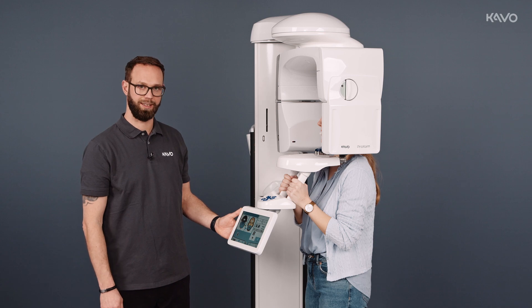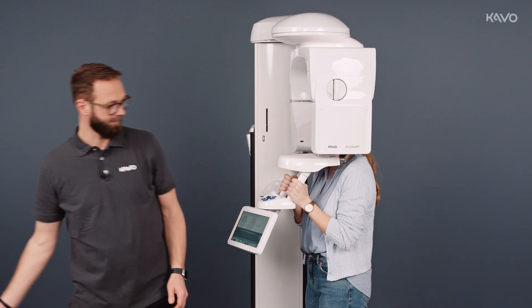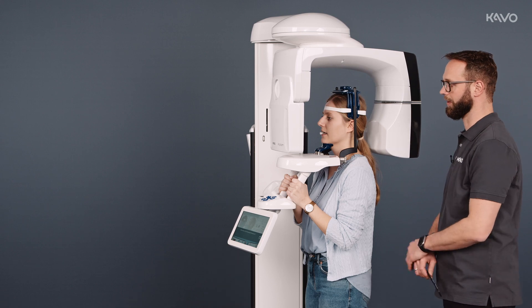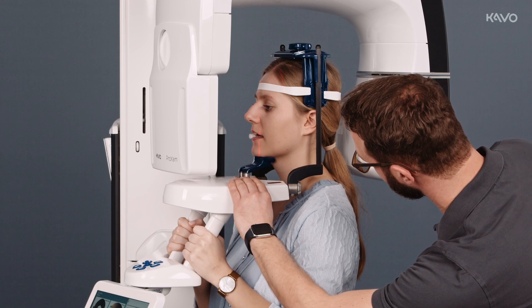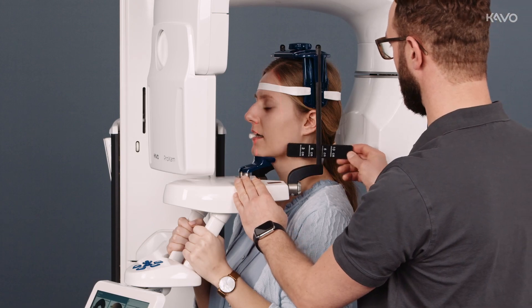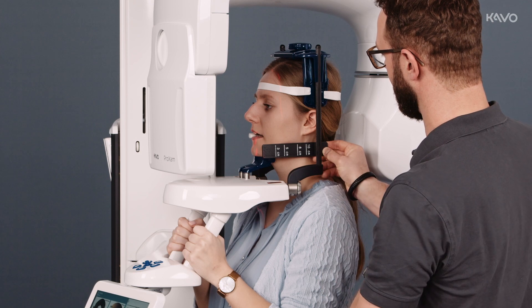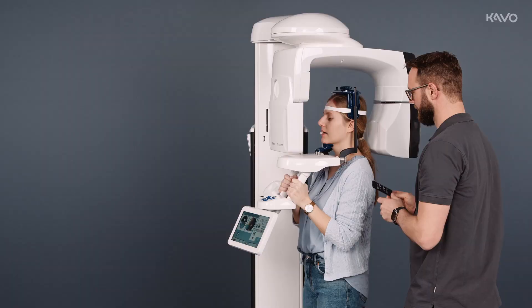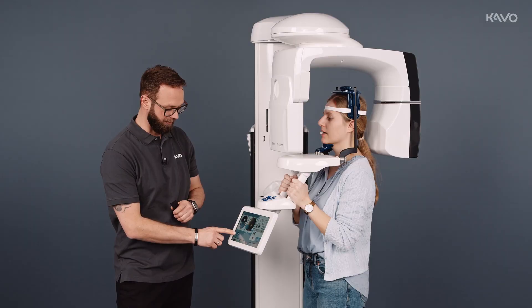To adjust the volume laterally, press the 90-degree setting. This moves the C-arm 90 degrees around the patient. We position the K9 laser in front of the foremost anterior tooth — now we have a zero point, from where we go 10 cm back. This is essentially our volume depth. Now we press 90 degrees again.